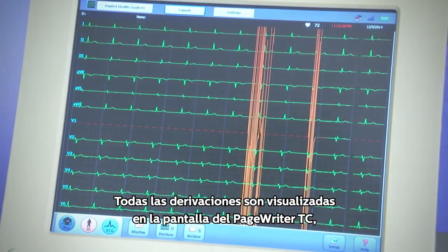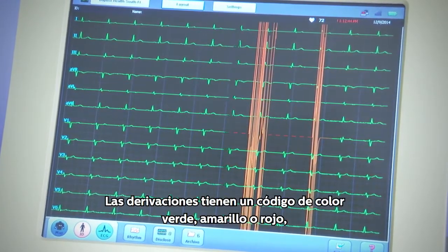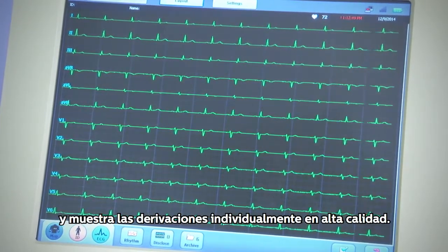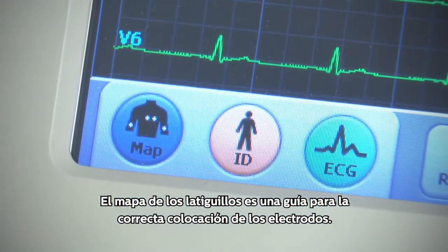All leads are displayed on the PageWriter TC screen as the patient cable is connected. Leads are color coded green, yellow, or red and show individual lead quality. Lead reversal warnings appear in a pop-up window. Lead map is a guide for correct lead placement.